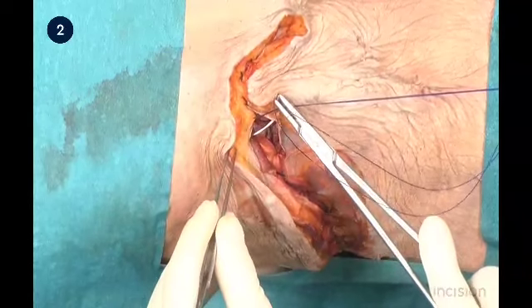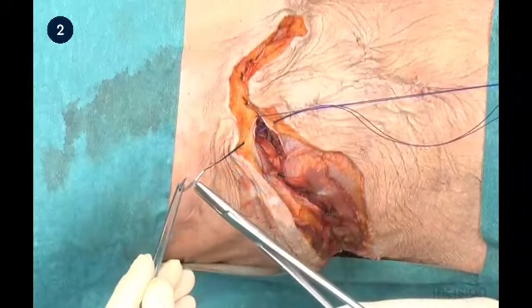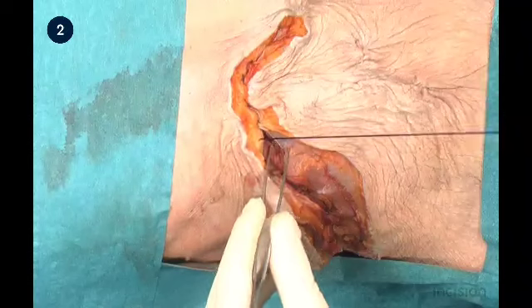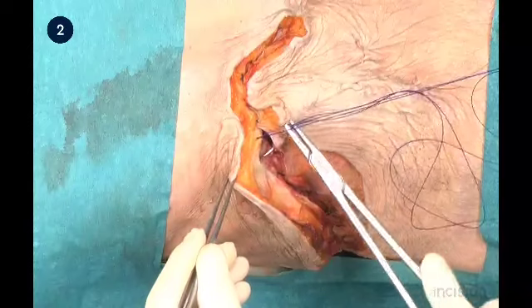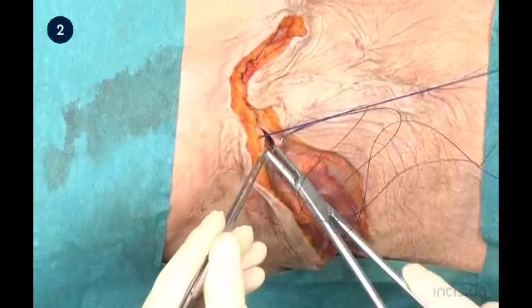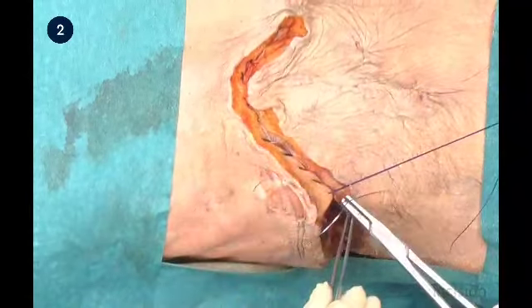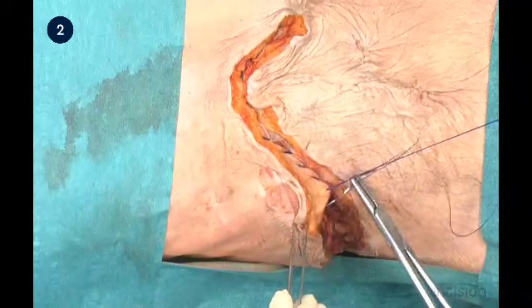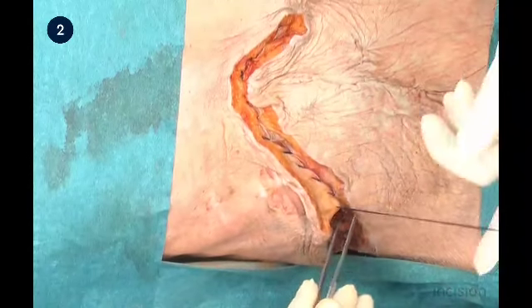With a second absorbable suture, the anterior rectus sheath is closed, again in a continuous manner with approximately 1 centimeter intervals. It is continued laterally to close the fascia of the external oblique muscle.